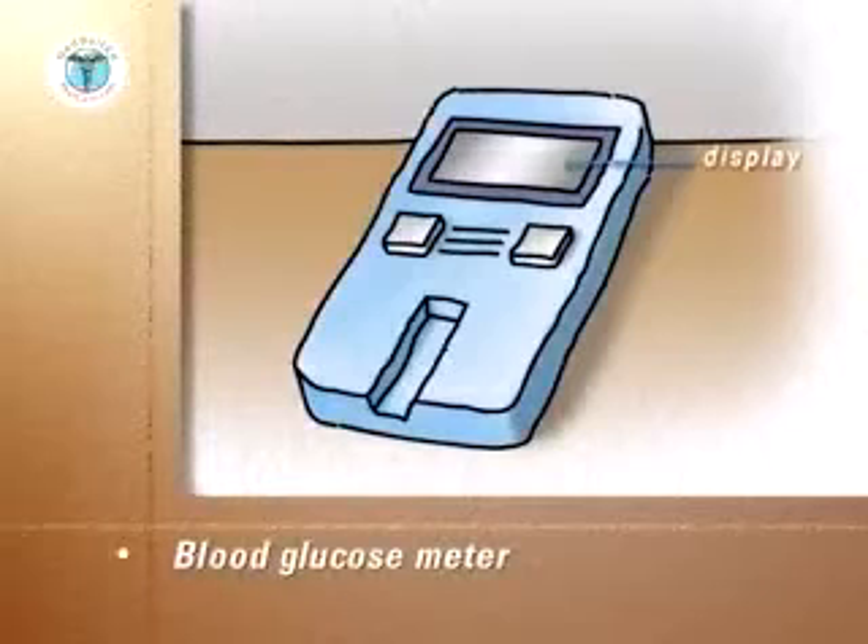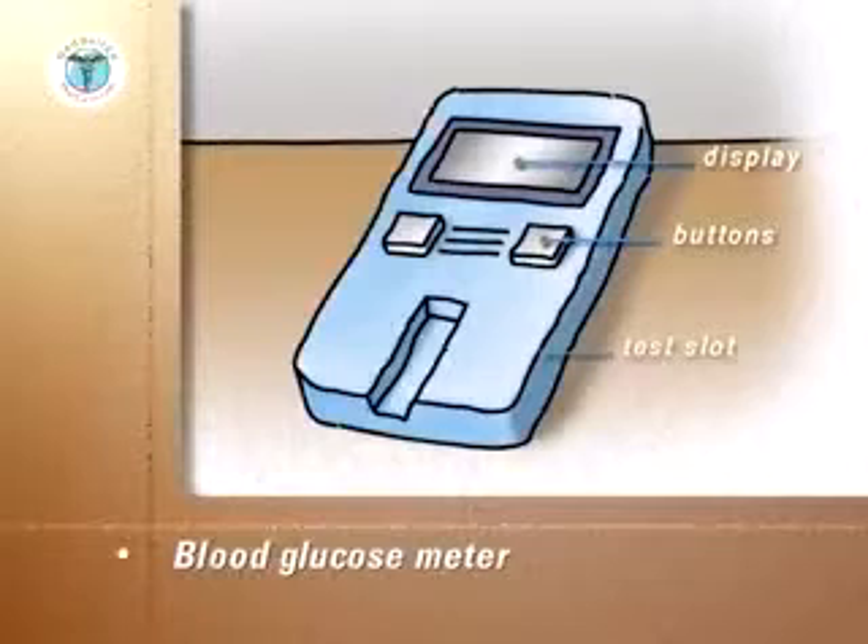The meter will have a display with blood sugar readings as shown, an on-off power button and a slot into which the test strips are inserted. In the back of the meter will be a compartment for batteries.